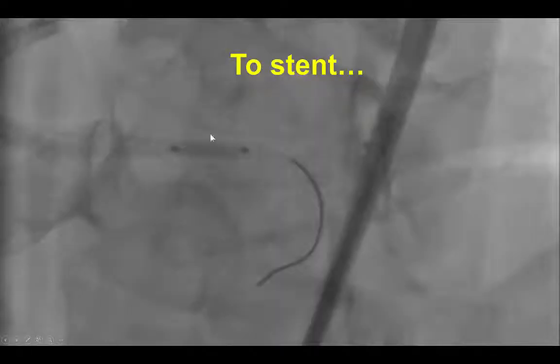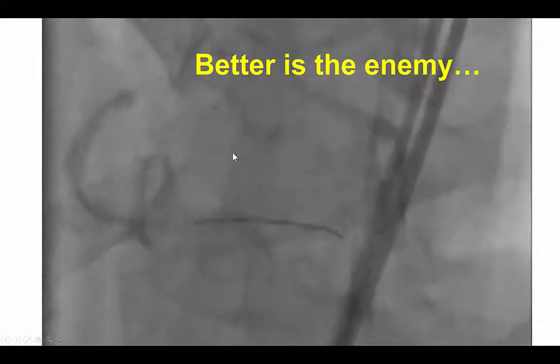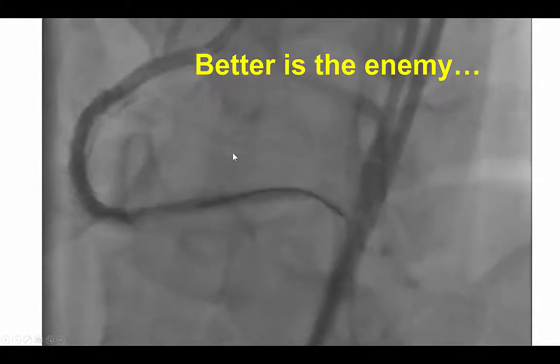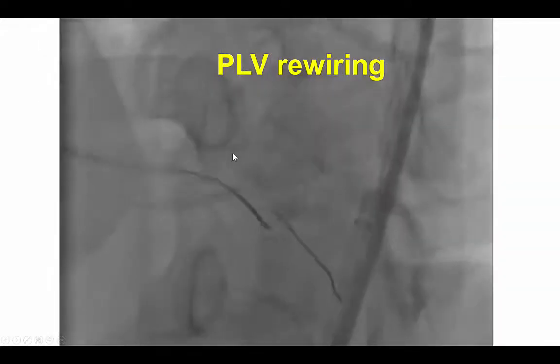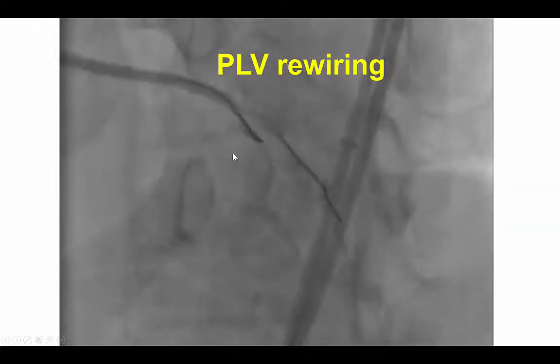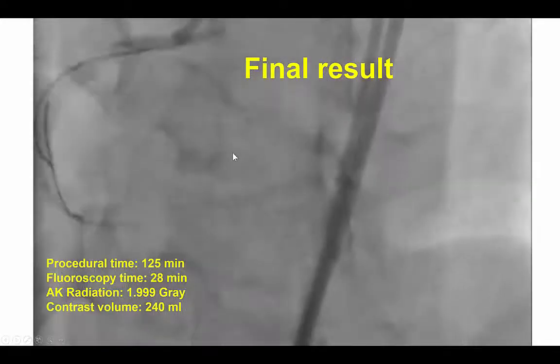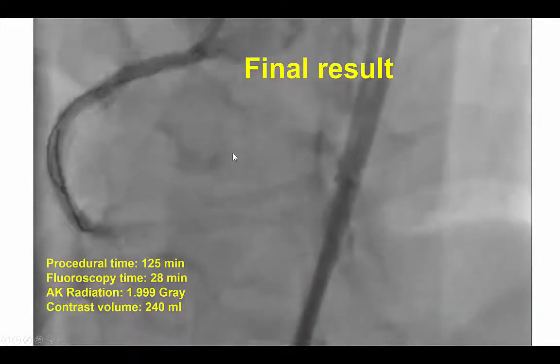To cut the long story short, we decided to place an additional short stent into the distal RCA. We then realized that was not the right decision because we lost the posterolateral vessel — this is why sometimes better is the enemy of the good. By trying to get a perfect result and potentially tack up a dissection, we ended up losing a side branch. Fortunately, we were able to advance a Pilot 200 into the posterolateral vessel, perform balloon dilation with a small balloon, and in the end we did have a good result restoring flow in both the PDA and the posterolateral branch.